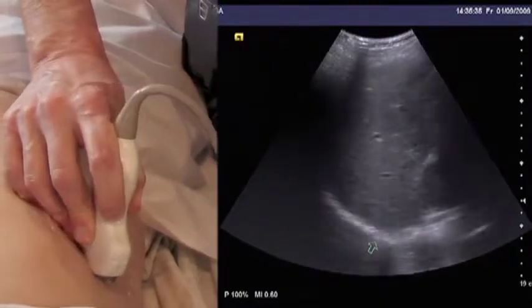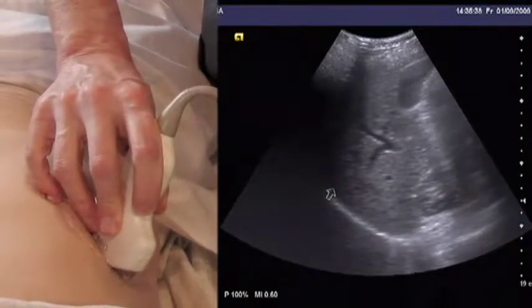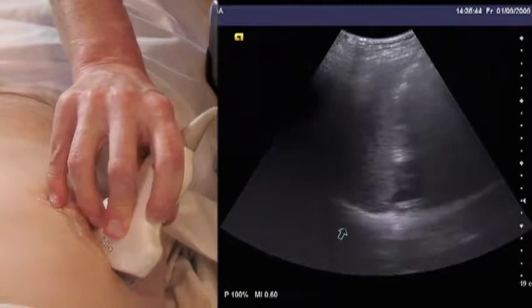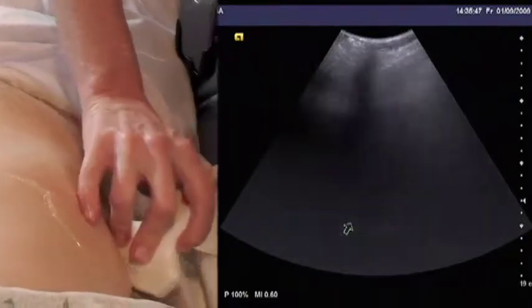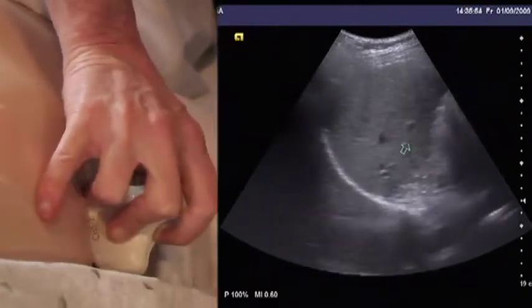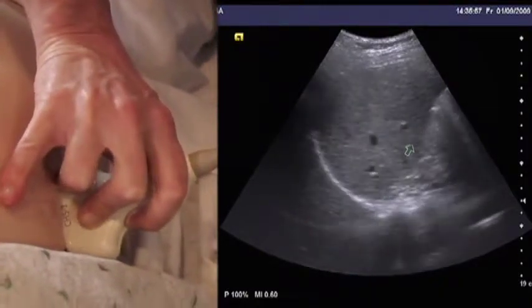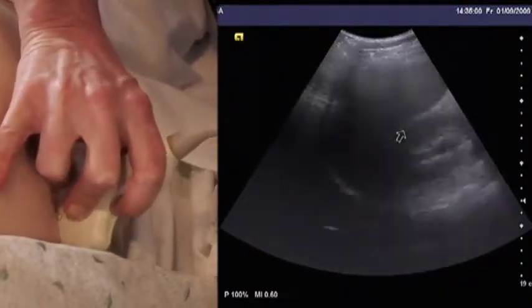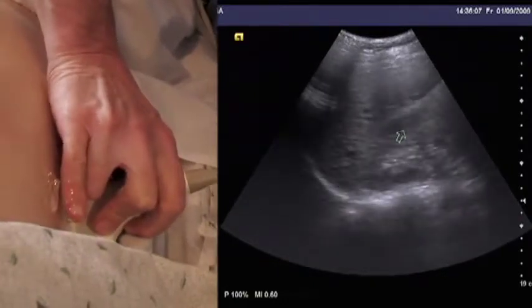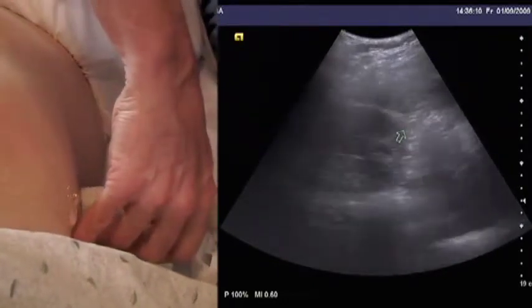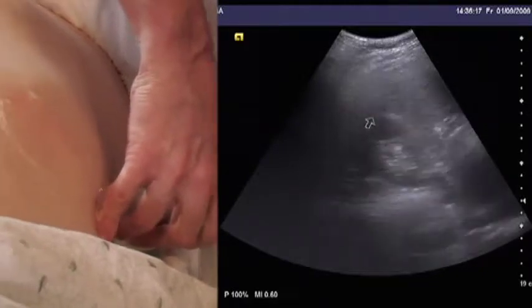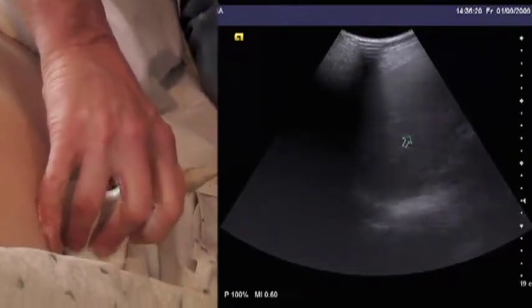We're going to check through all the tissue planes — you can see me moving the probe here. Then we check below the diaphragm, scanning through all tissue planes. Then we move down and focus on Morrison's pouch, which is the interface between the liver and the kidney. I scan all the way through; the kidney disappears completely medially, and I scan all the way to the back, staying off rib spaces. If there's any question, I can go transversely and scan right down along the kidney to make sure there's no free fluid in any location around the kidney whatsoever. This concludes the right upper quadrant exam.